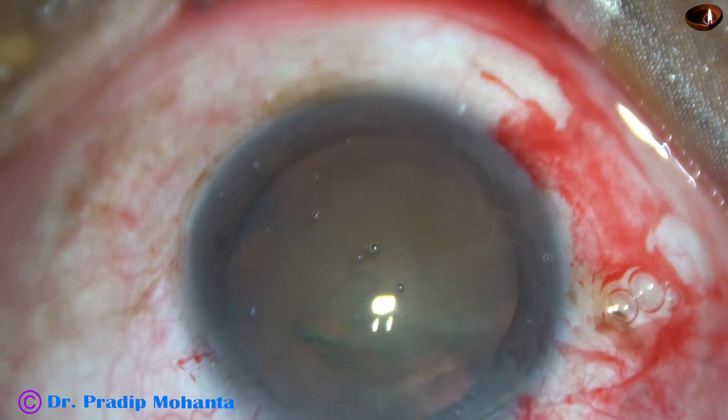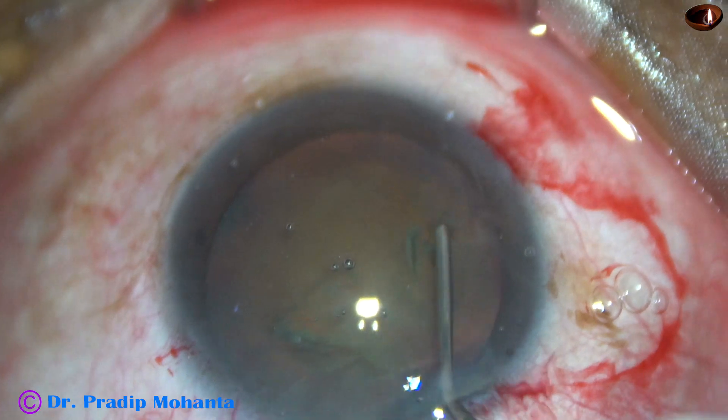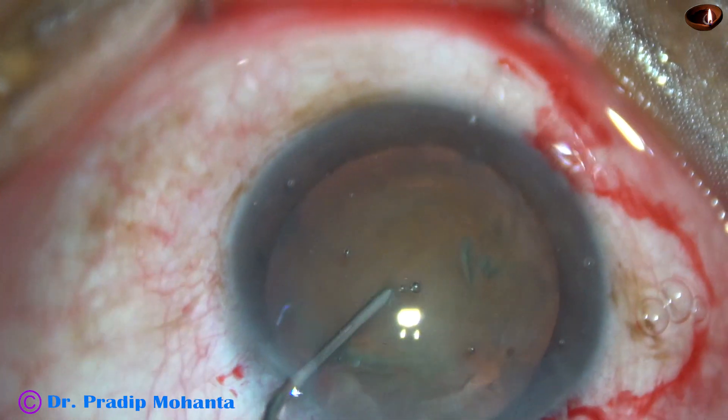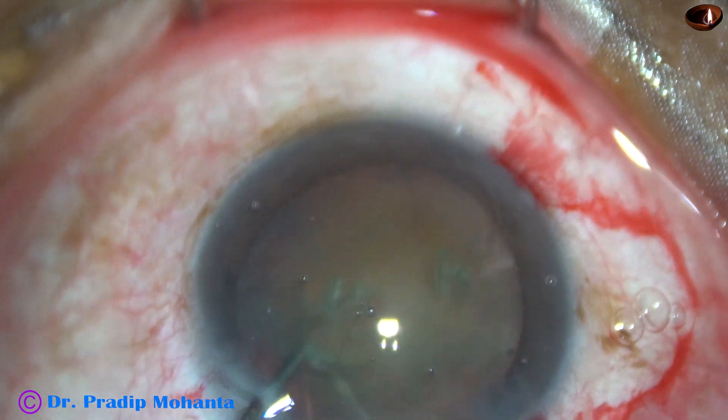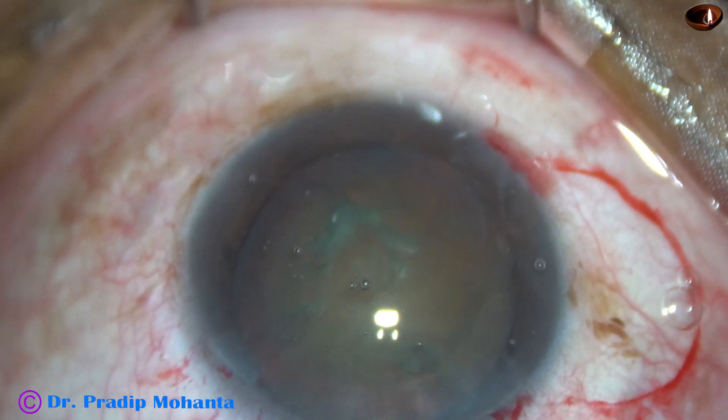Capsulorhexis is done. The nucleus is tapped and then the nucleus is rotated. The nucleus is free now.